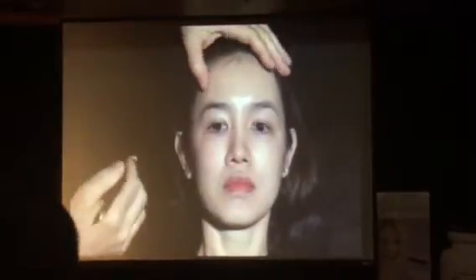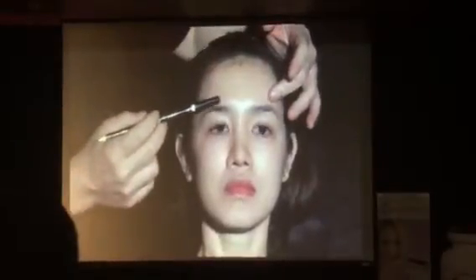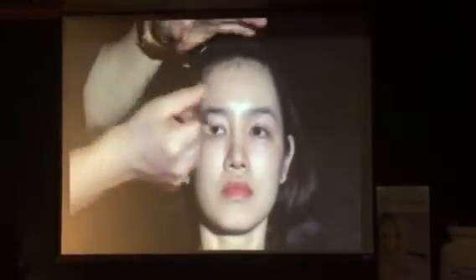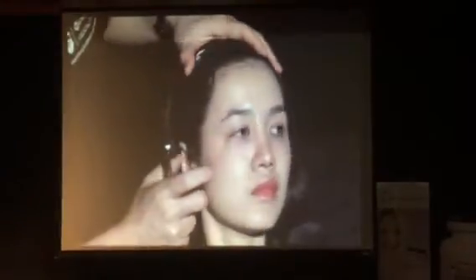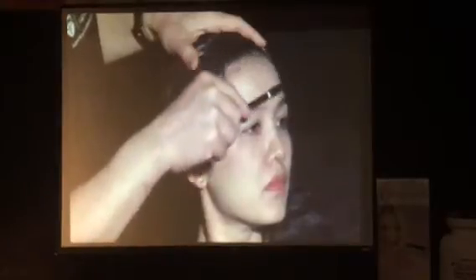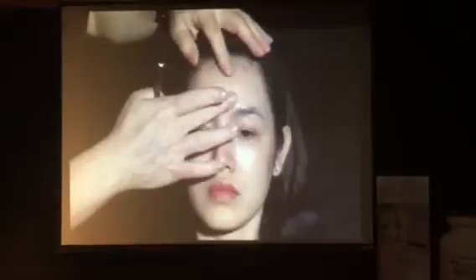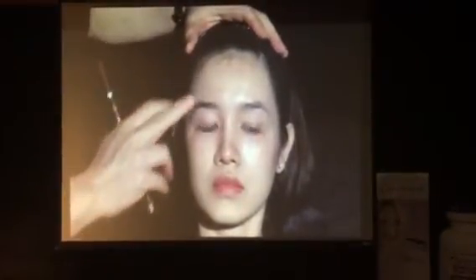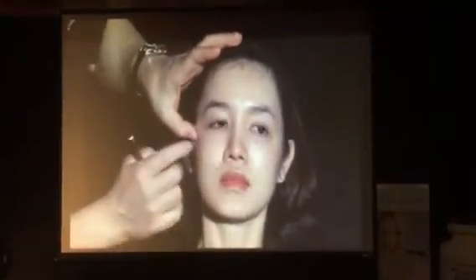And for the upper face, we can see a little bit of sunkenness over the lateral area, but it's not too prominent. It's okay. If we take a look from this point of view, the curve over the forehead is very good. Very beautiful forehead, but a little bit sunken over the temple, just a little bit.